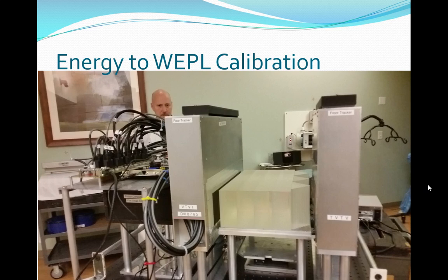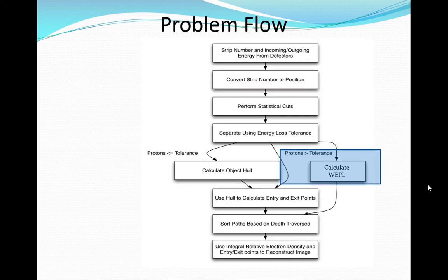But we use that calibration phantom. We do other ones as well. To do the center line, we also have a single wire that goes through, just like you do for x-rays. Remember, a line gives you your line spread? So we do a line spread every day. There's a bunch of different ones we'll do to calculate the statistics and what the modulation transfer function is for it. All right.